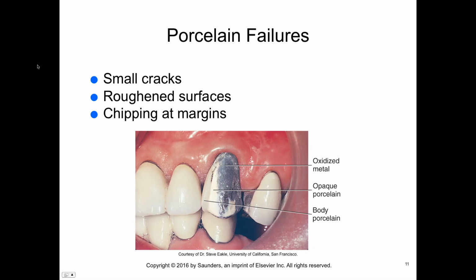It's important for the clinician to identify the junction of the tooth and the margins of any ceramic restorations, because ultrasonic scalers, if improperly applied, can chip and craze margins of aesthetic material.